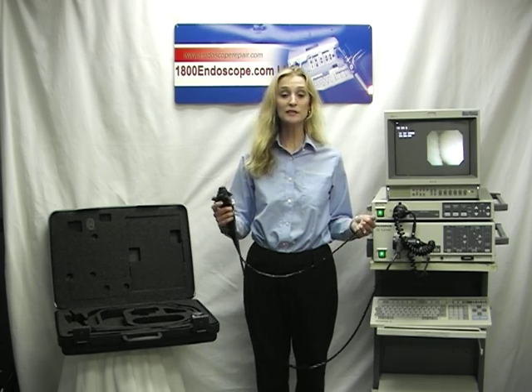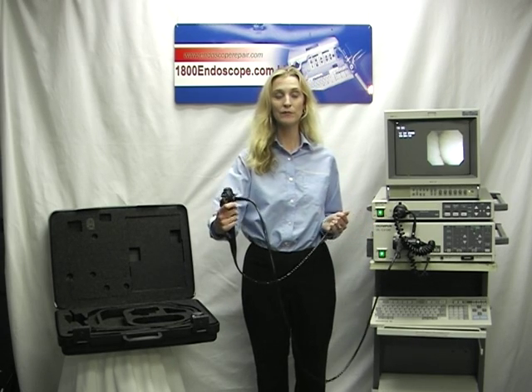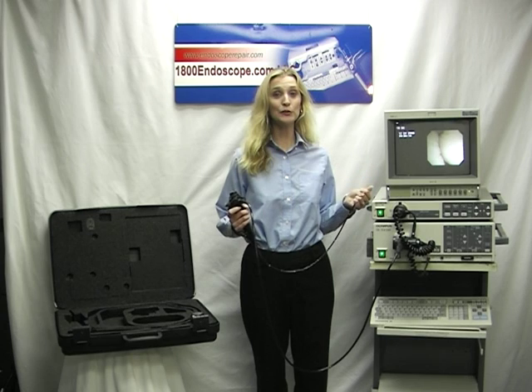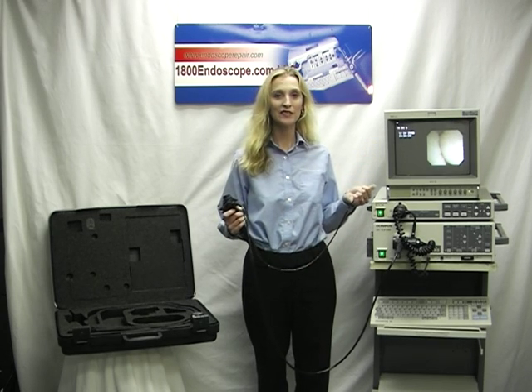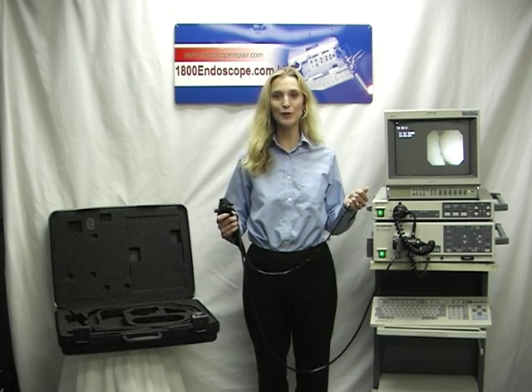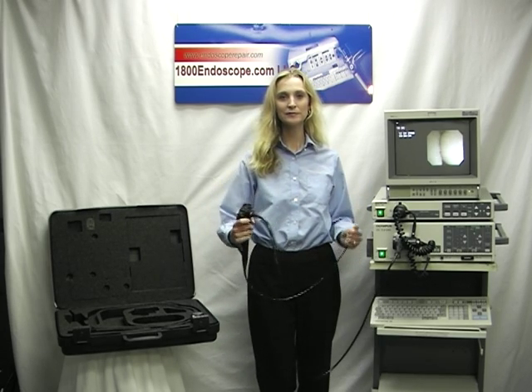Each bronchoscope has been inspected by factory-trained technicians. Cada bronchoscopio ha sido inspeccionado por técnicos entrenados de fabricación. It also includes a 13-inch monitor. También incluye un monitor de 13 pulgadas. Thank you for choosing 1800Endoscope.com. Gracias por elegir 1800Endoscope.com.